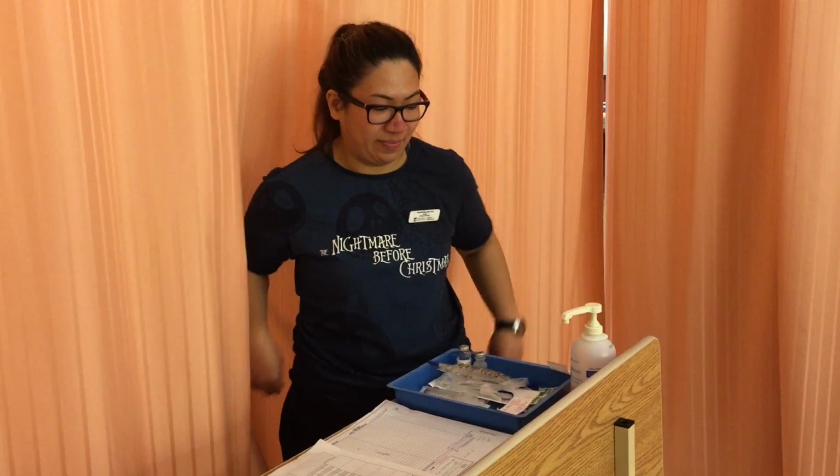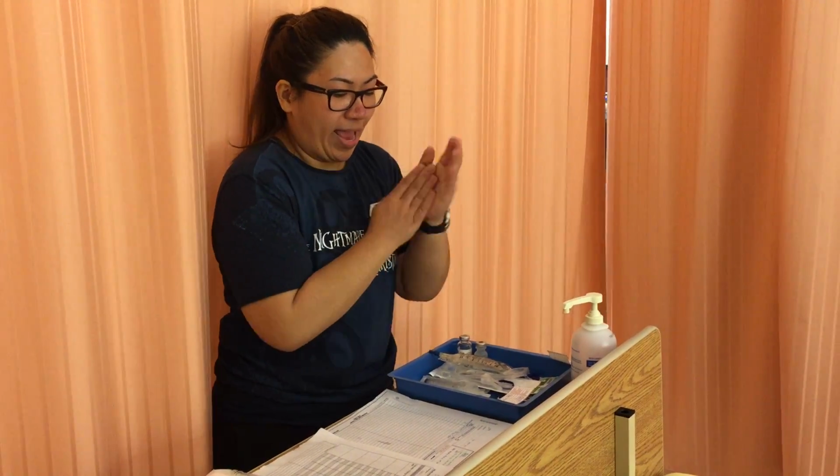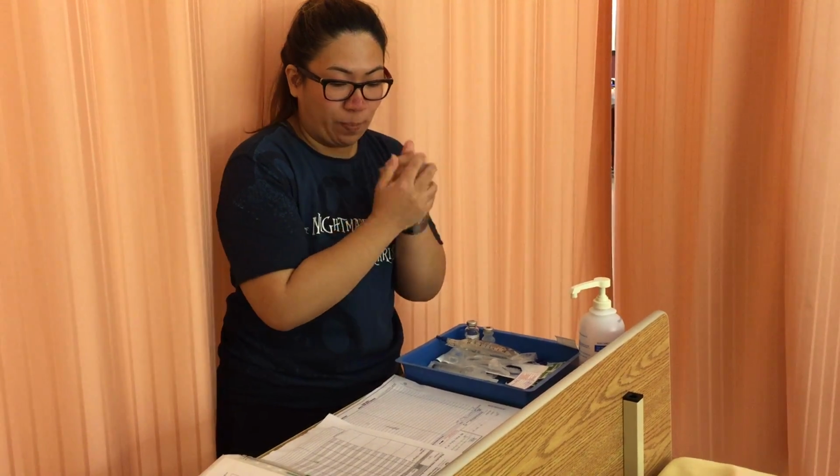Pamela de la Cruz, and I would be doing a video demonstration of how to reconstitute, dilute, and administer an IV medication through a mini bag. First, I would do hand hygiene. And next, I will check my doctor's order and compare it to my MAR.